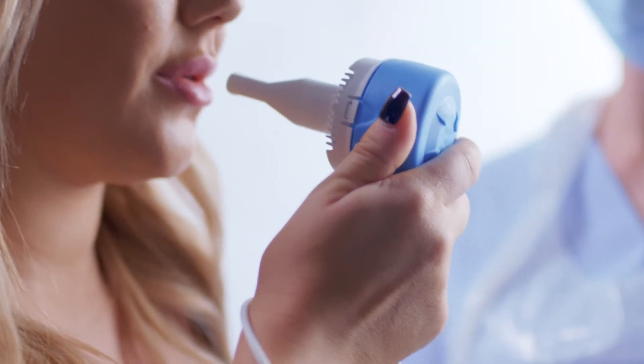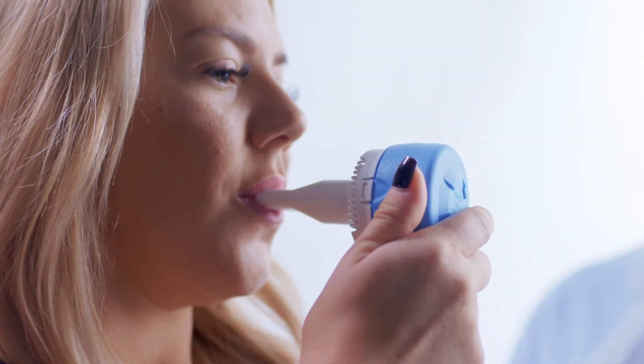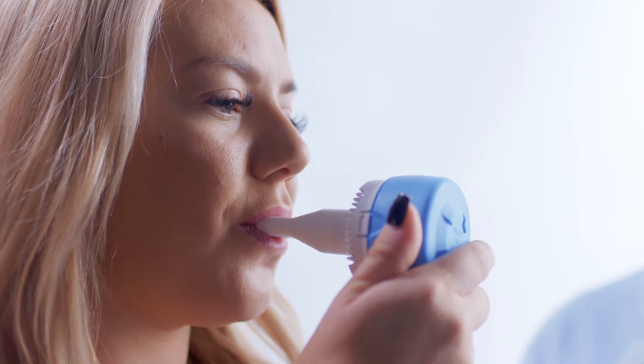Ultraflow is one of the best performing inhaled analgesia systems available. Its low resistance means minimal respiratory effort is required by the mother, so she can preserve energy for the birth.